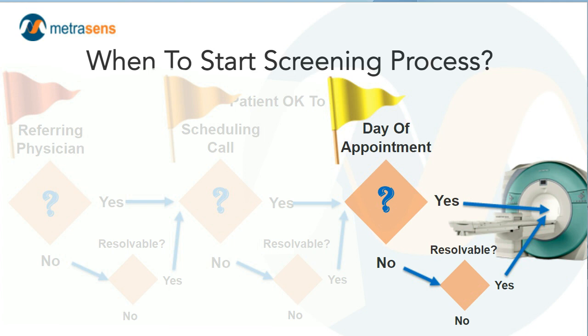And the objective is that we should have effectively no delays or denials of study on the day of, at least not for safety reasons, if we follow these steps prior. In terms of data collection and data sharing and reviewing with the radiographers, the technologists, the radiologists to make sure that these questions are fully resolved or resolvable on the day of the study, then proceeding with the exam should be quite simple, straightforward, and direct.